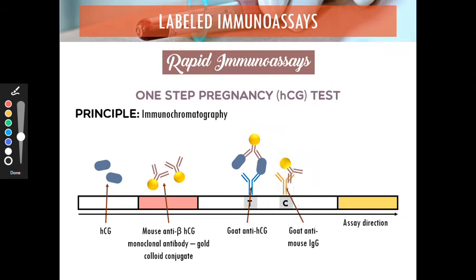Okay? All right, generally in most of your test kits, but some test kits have a different procedure and a different interpretation, like drug test kits. Okay? All right, but that's generally the interpretation, or the principle, of your immunochromatography kits. I hope you get it, dears. So I included these slides in your handout so that you at least have an example of an immunochromatography kit so you can understand better.